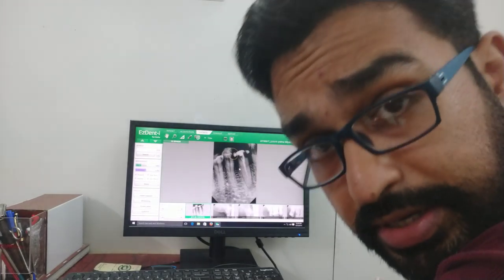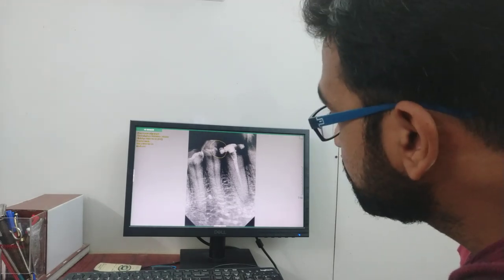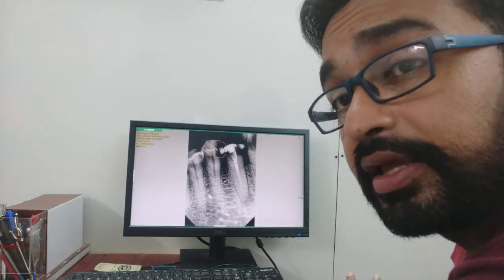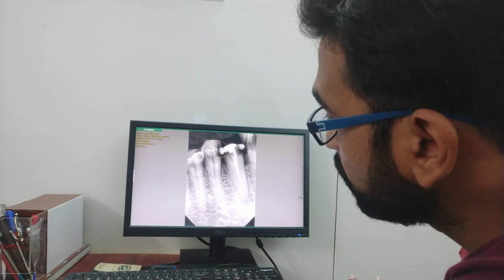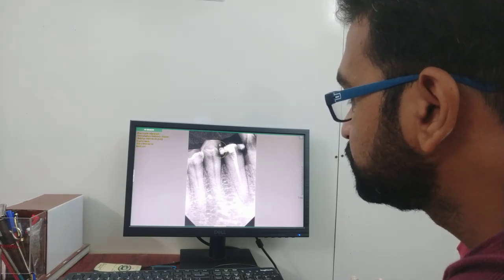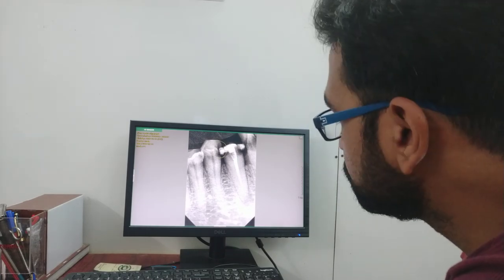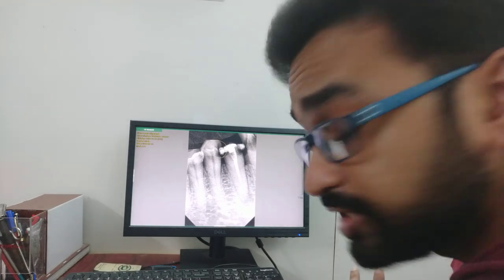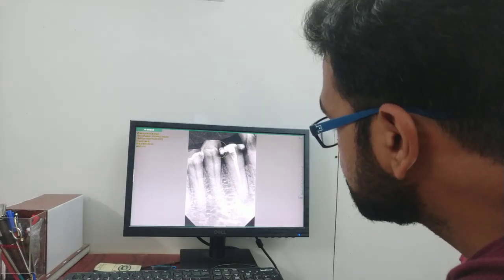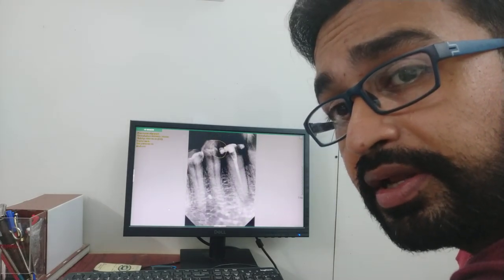The next case was again a senior citizen patient, around 65 years of age. I am doing a root canal of this tooth, but I got a doubt and thought let me check the carious lesion proximity to this second premolar. The cavity is almost approximating the pulp of this tooth. What you see inside the canal is not obturation — it is calcium hydroxide paste. The intracanal medicament I used here is Ultracal, which is a very good intracanal medicament. There is a periapical lesion in this tooth.